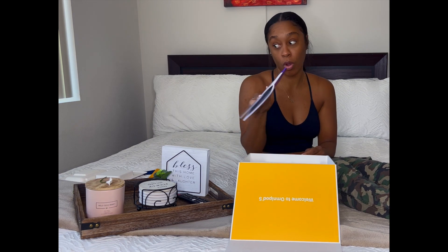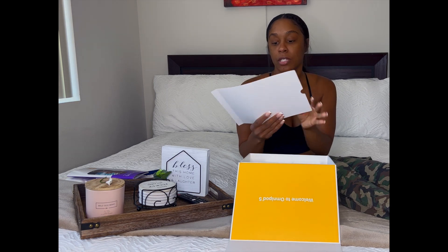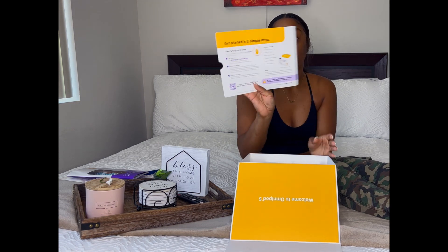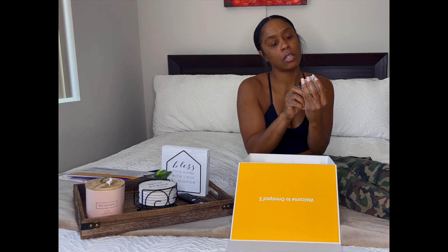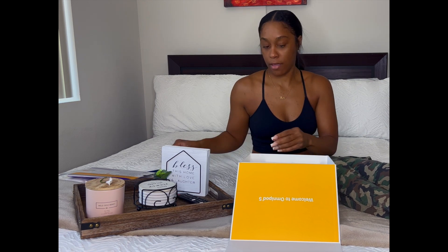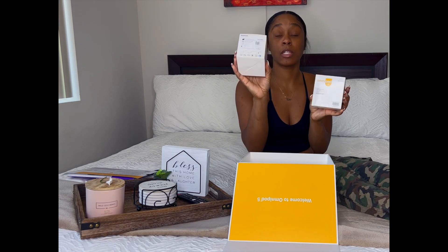It also comes with the quick start guide. I did have the OmniPod 4 so I don't really need all of this, but if it's your first time I would definitely recommend you follow the steps, sign up, and get the training. It also comes with the charger and the brick.